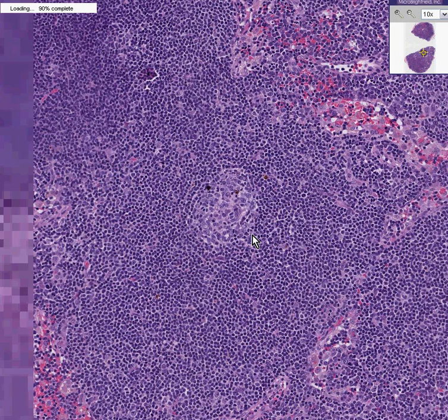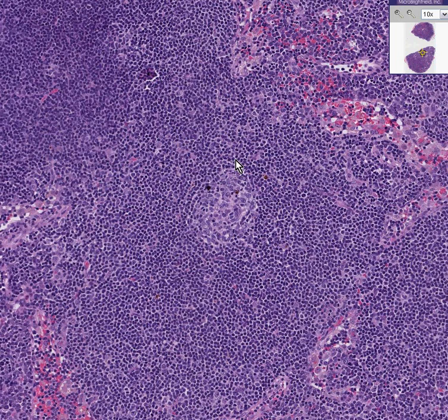These look like the normal lighter colored lymphocytes of a germinal center, and here the smaller, darker, uniform, almost normal looking ones in the mantle zone. This is a mantle cell lymphoma, mantle zone lymphoma. Thank you very much.